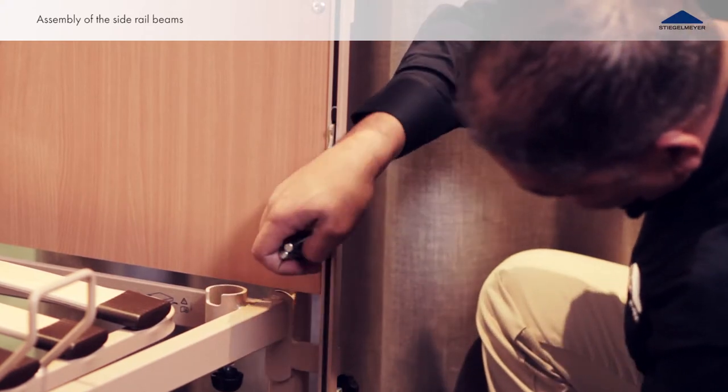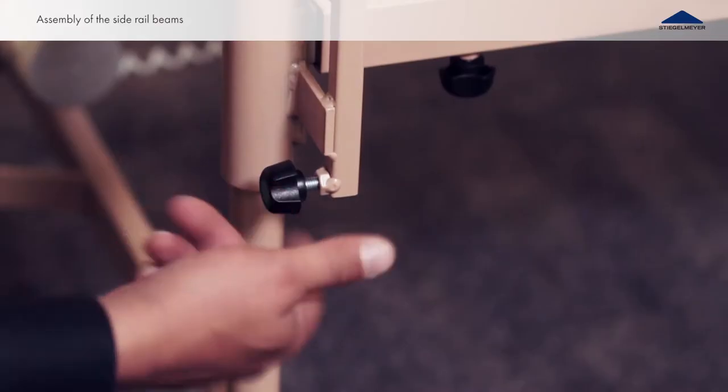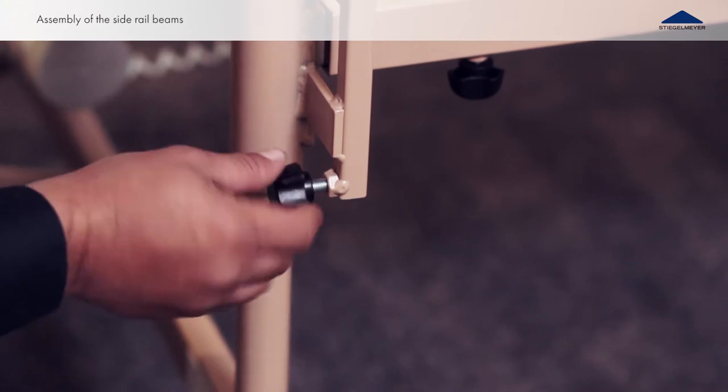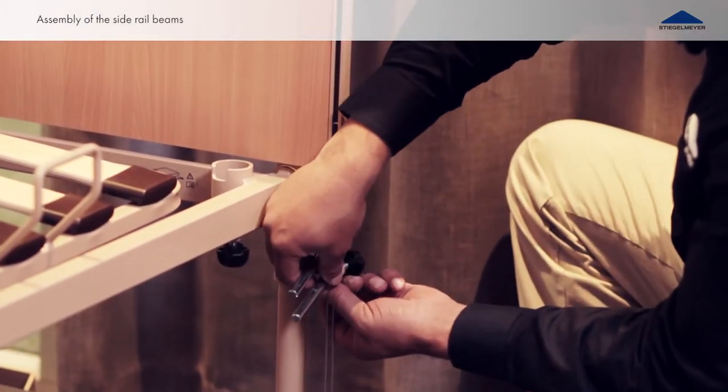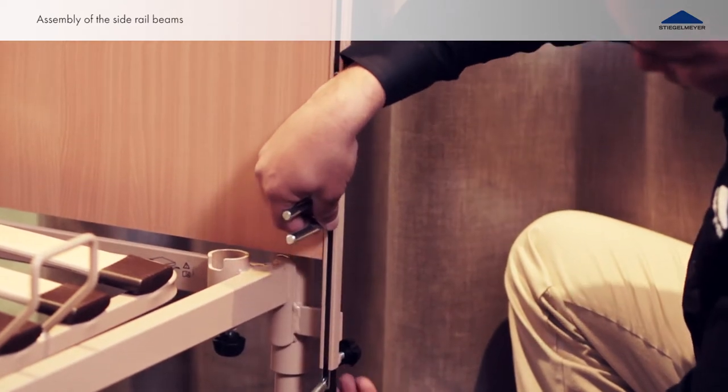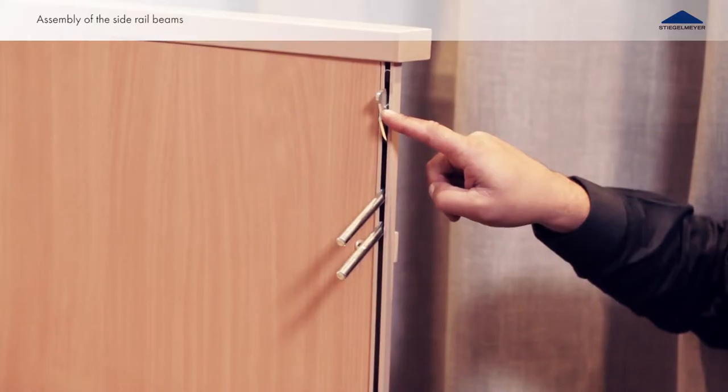Begin at the head side end board. Loosen the knurled screw on the bottom end of the guide track and insert the plastic slide from below. The release lever must be pointing up.